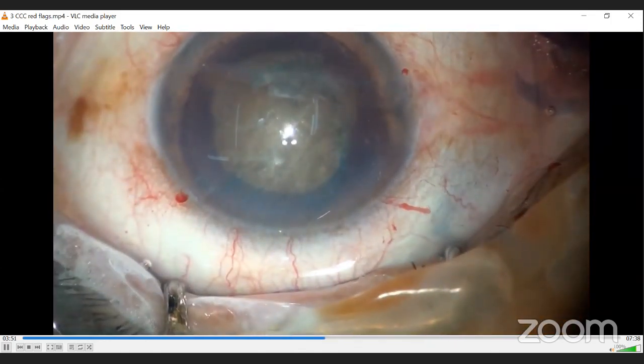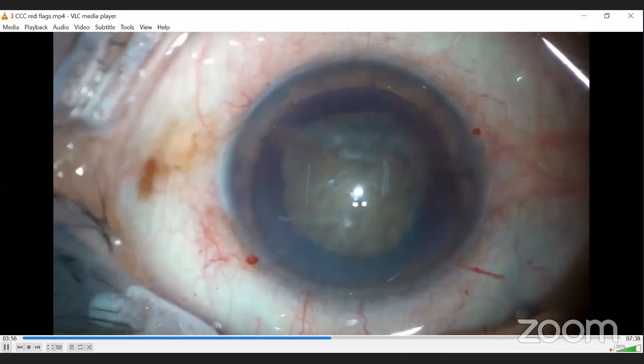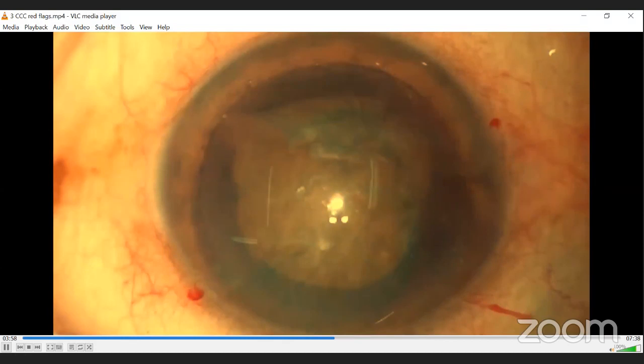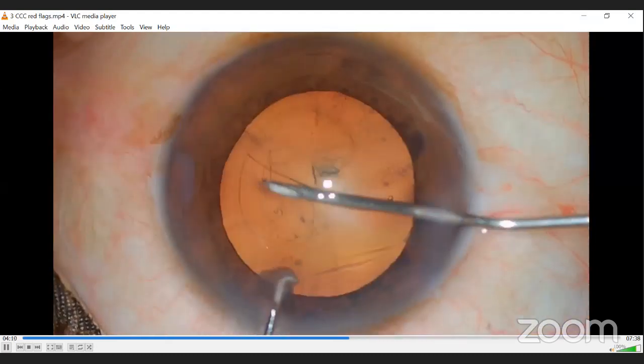So the Capsulorhexis extended from that side. And why did it happen? Because of the three things which I mentioned: not following the rule of triangle, not keeping the flap flat on the anterior capsule, and not visualizing the tip of the cystitome. Let's look at another case.